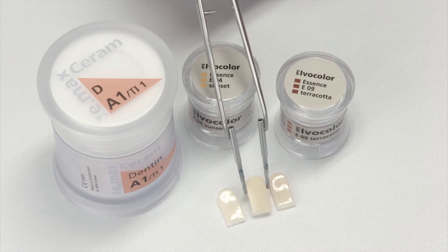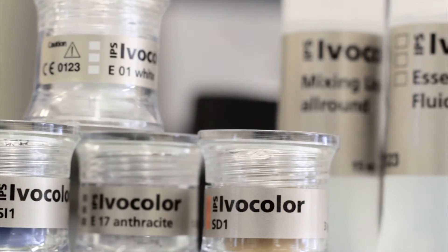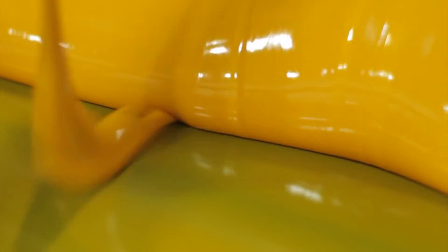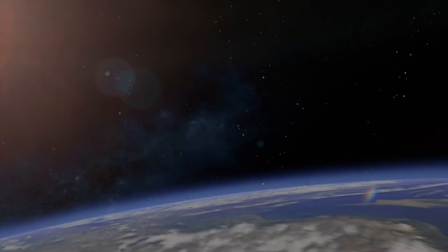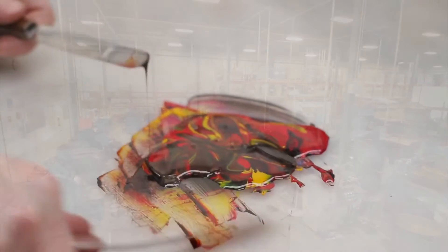Ivoclar Vivident has done it again with their stain and glaze system, Ivocolor. This game changer combines ease of use and artistic elements to form a near perfect product. Truly universal and ushering in a new paradigm, this system is the new standard for both high volume production labs and hardcore artists alike.